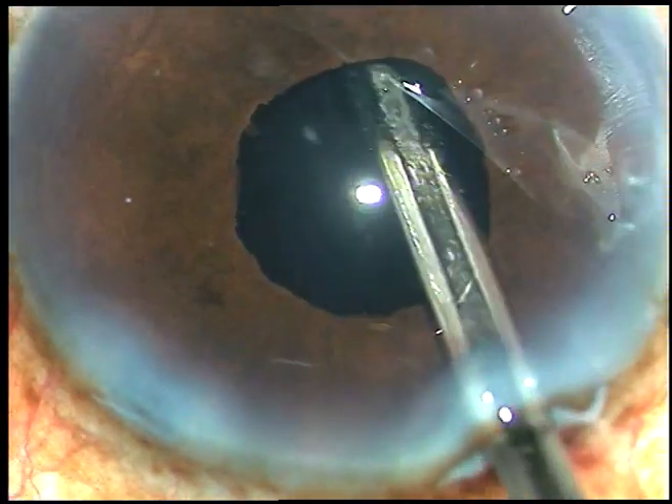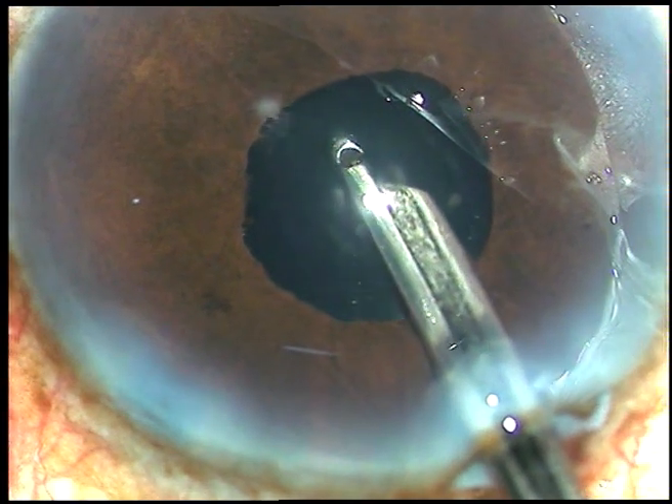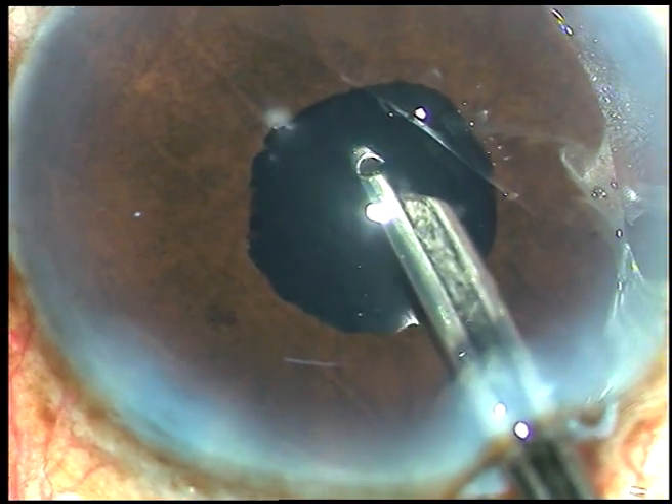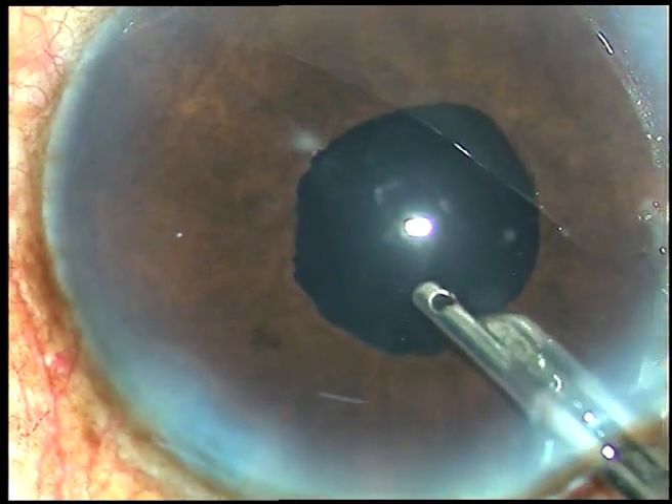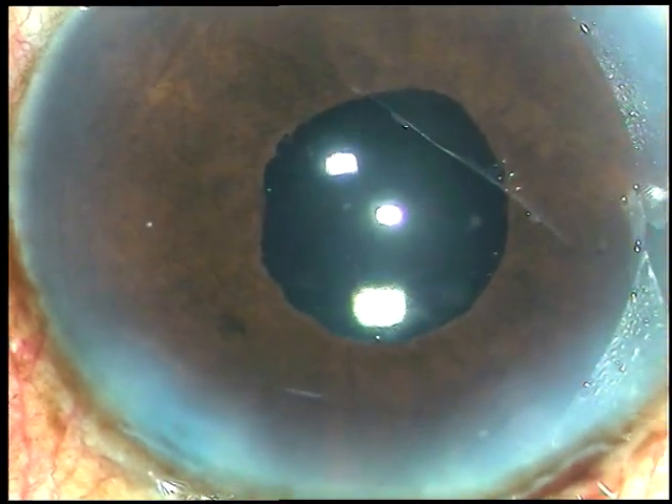See how beautiful the pupil is at the conclusion of surgery. Thank you very much for watching. Hope this video will encourage you to use pupil expansion devices in small pupils.